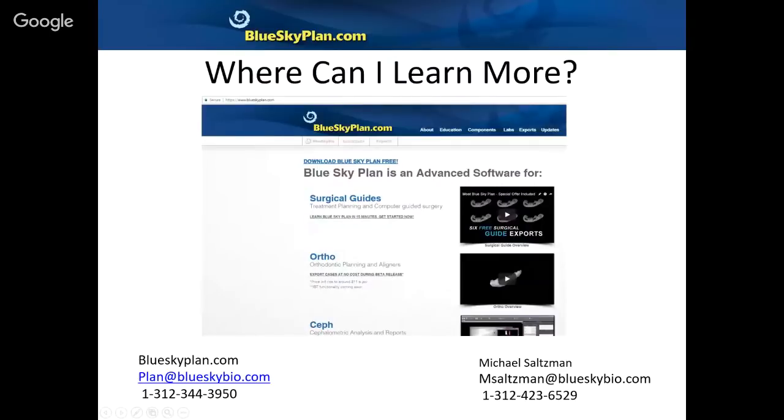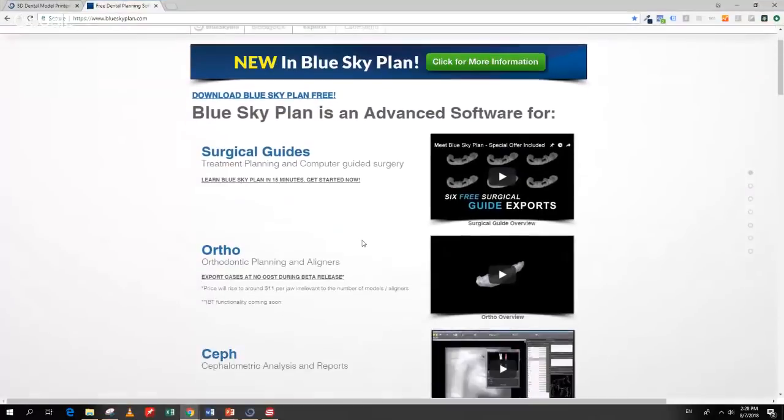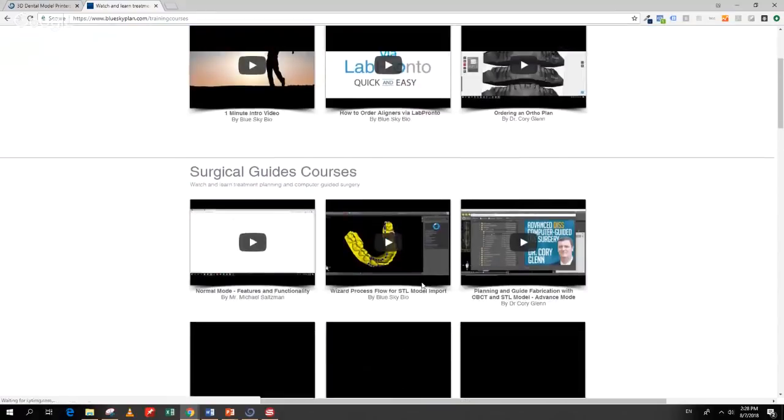I also just want to show our Blue Sky Plan website, because one of the things that are included in the website that I think is not really taken advantage of is that we have a very rich education section that's giving free tutorials and free education based on the topic.